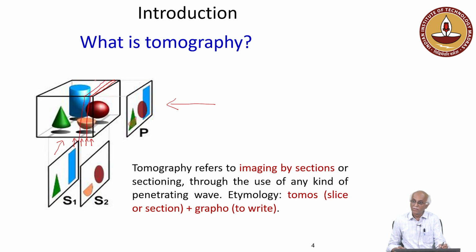We can cut one layer at a time and see what is located where, is it not? So this cutting is nothing but tomography.